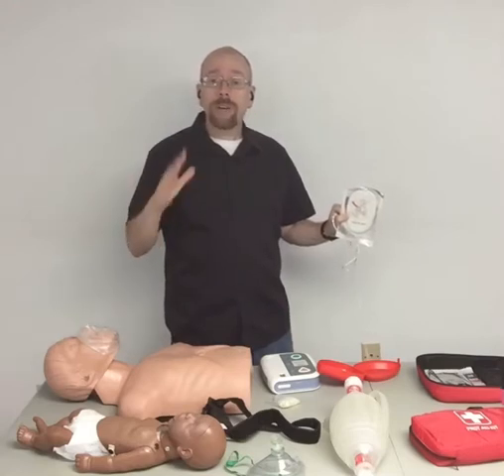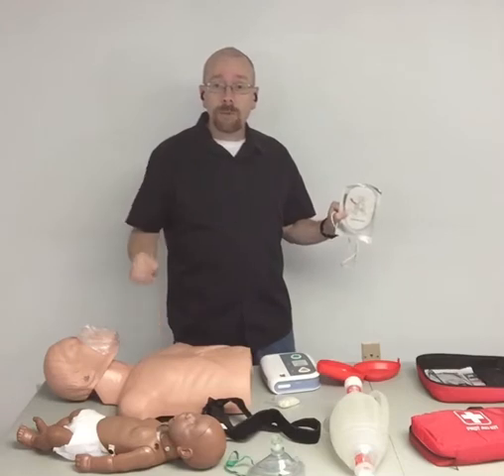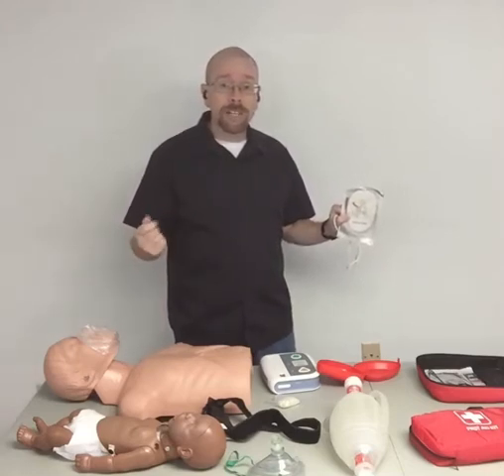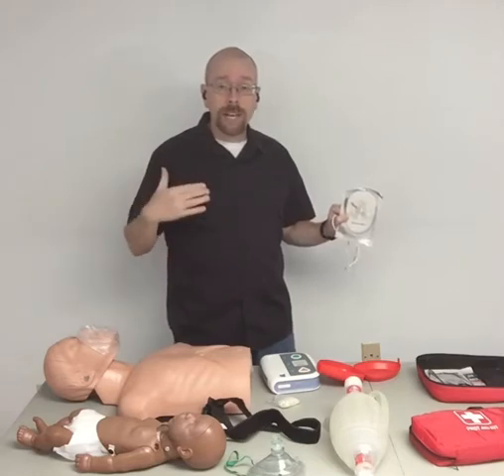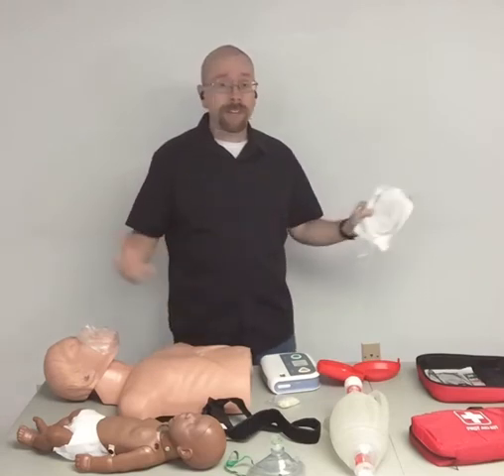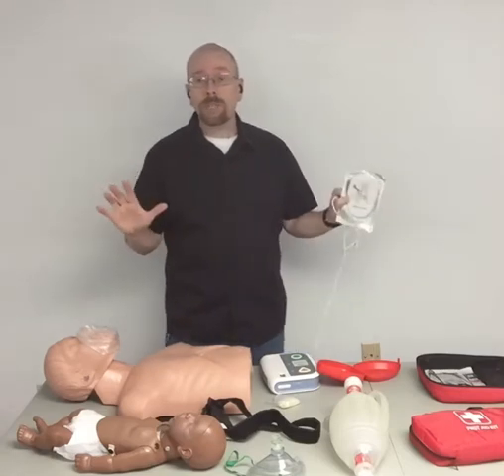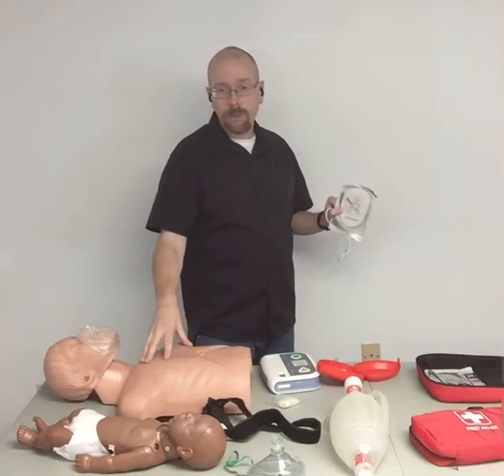We want to make sure we have gloves on or use something to protect our hands to pull that patch off. Nitroglycerin, if it comes in contact with our skin and we have a normally low blood pressure, it could lower our blood pressure enough that we get a headache and possibly pass out right next to the patient. You're no good to the patient if you're unconscious next to him, so make sure you protect yourself before you come in contact with the patient's nitroglycerin patch.